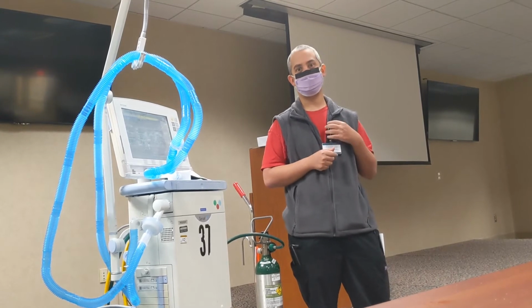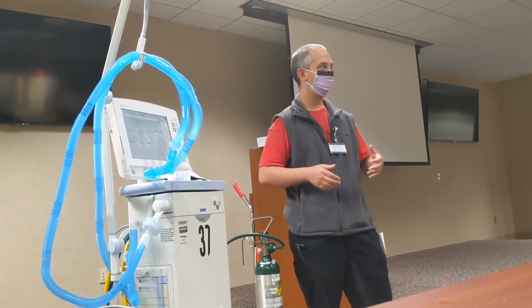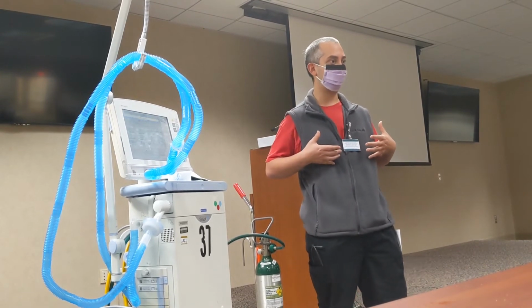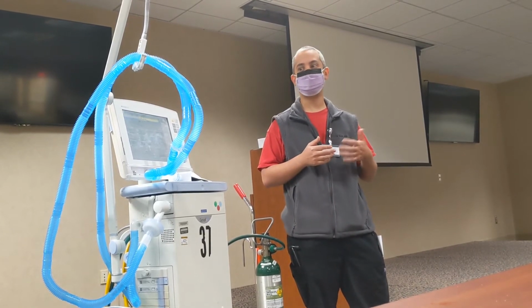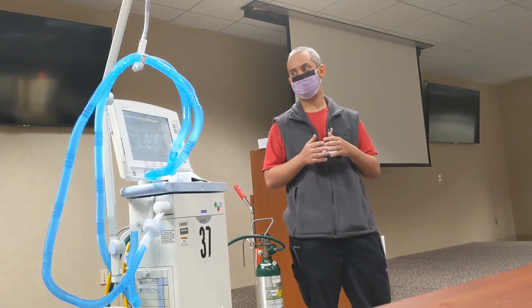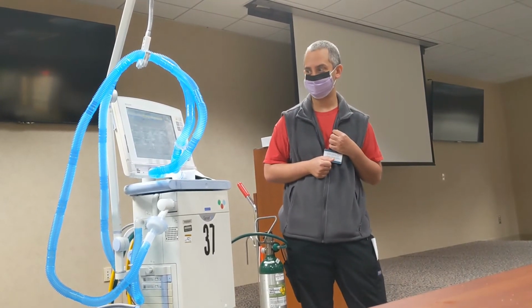and based on the CO2 that you're getting on your gas. So I usually start out at somewhere between like 4.5 and 5.5, because you really want to have a long T high to really recruit everything up and keep the oxygenation up as much as possible. But the byproduct of that is that you may lose some in ventilation. So that's pretty much where you're going to have to adjust your T high to get your CO2 back to where you want it.